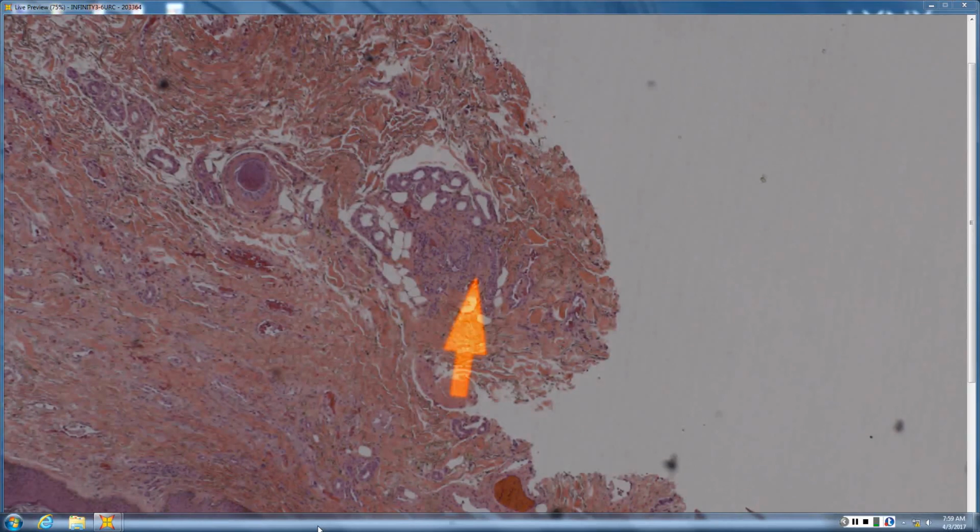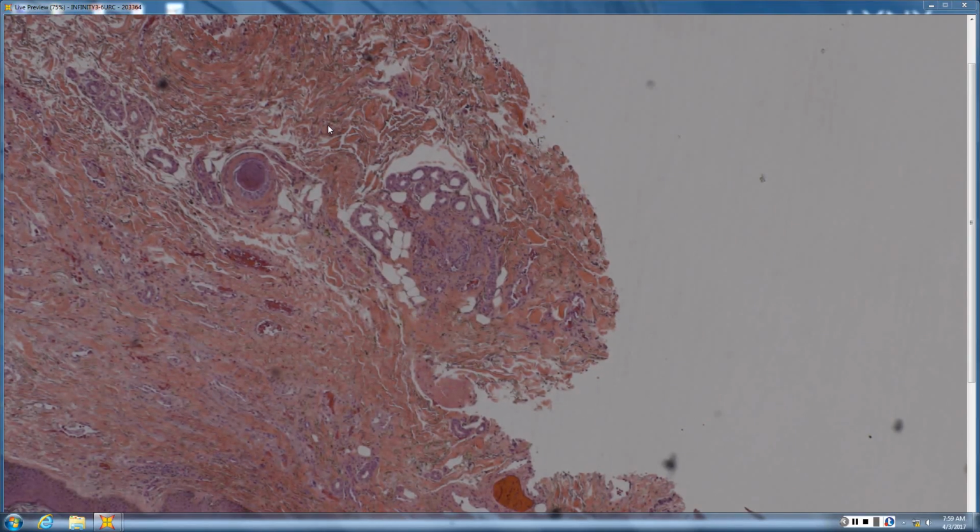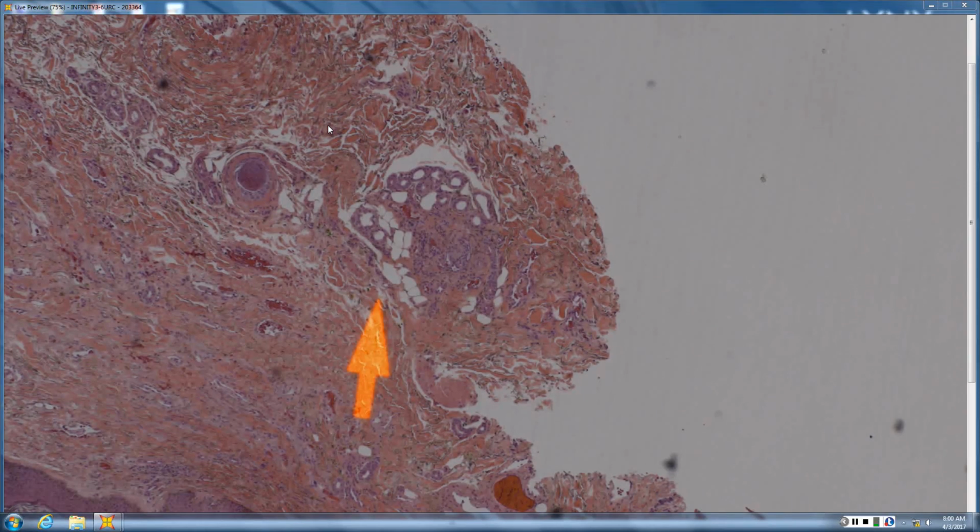Those vessels are more round, like hemangioma. Those are often painful, dusky, sweaty tumors in someone whose last name is Byler or something else Pennsylvania Dutch. Almost 100% of them are from central Pennsylvania or rural Ohio where they're Amish. So that's an Amish tumor, the eccrine angiomatous hamartoma. But here, the top is kind of staghorn, almost like a patch stage of Kaposi's. The deep part is patchy and wrapped around pre-existing eccrine coil like a plaque KS, but it's HHV8 negative and it's a solitary lesion.